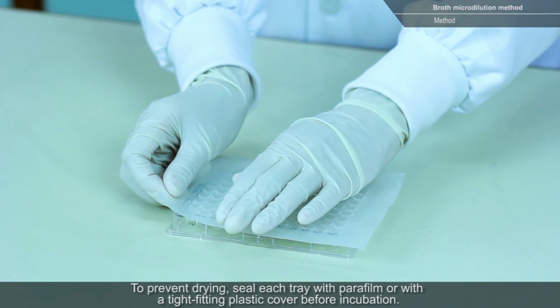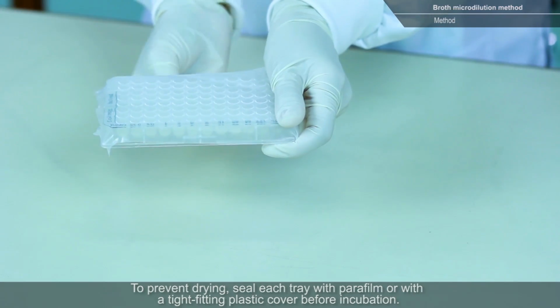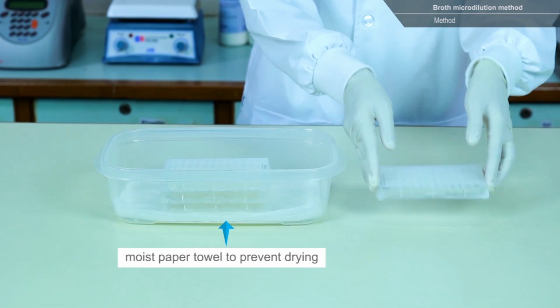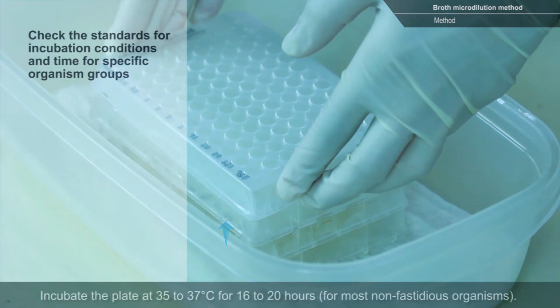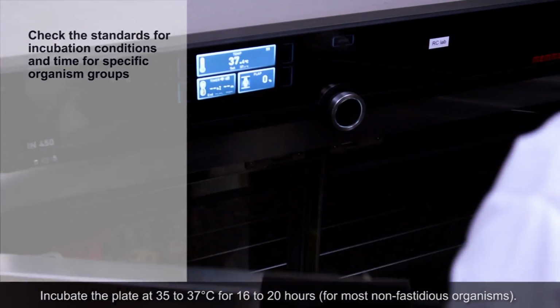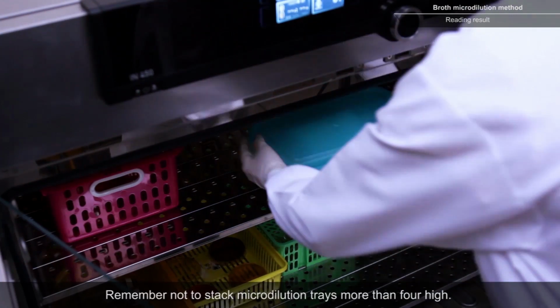To prevent drying, seal each tray with parafilm or with a tight-fitting plastic cover before incubation. Incubate the plate at 35 to 37 degrees Celsius for 16 to 20 hours. Remember not to stack microdilution trays more than 4 high.